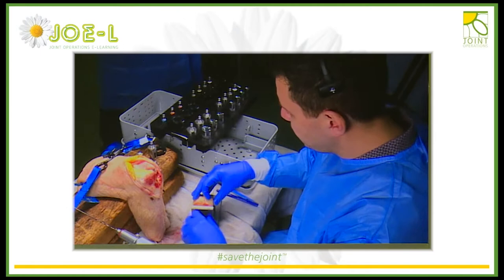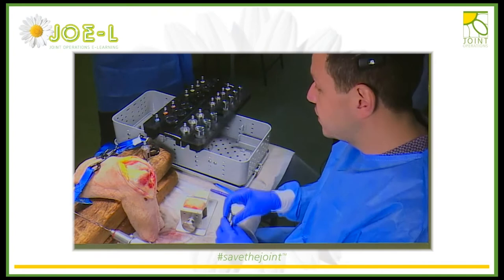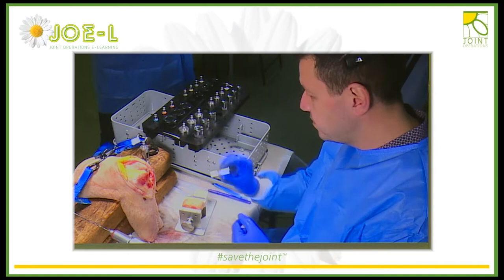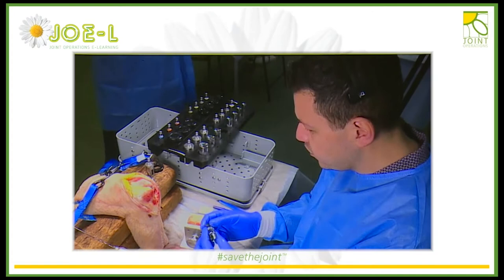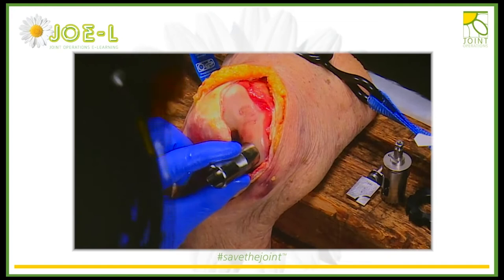The smaller the defect, the less important the radius match is. The cutoff is somewhere around 20 to 22 millimeters, where it doesn't really matter so much where you take the donor plug from or what size the condyle is. Essentially what you're trying to do is replace the exact plug relative to the defect on the knee from the same location on the donor. This is our defect here that we've created. I've already measured it — it's 20 millimeters. Place the cylinder flat on the condyle, perpendicular to the defect, making sure it's completely covered.